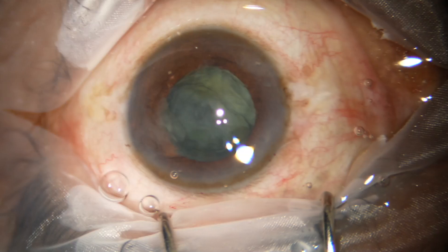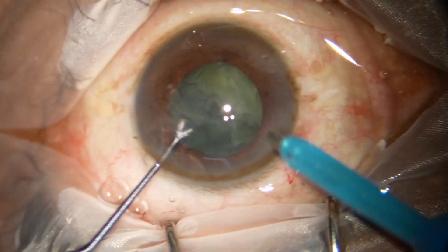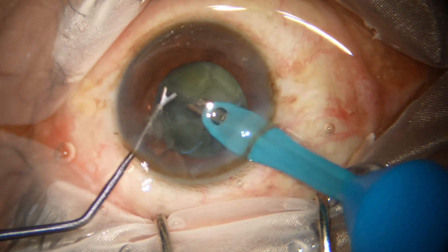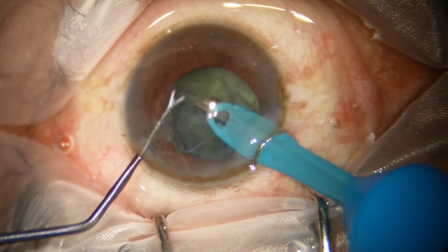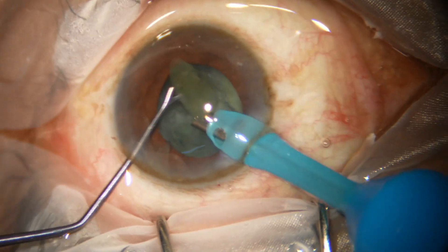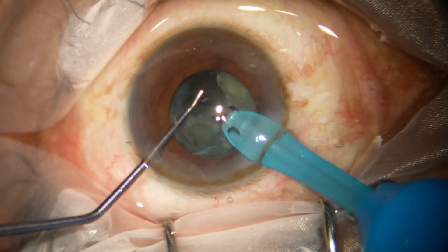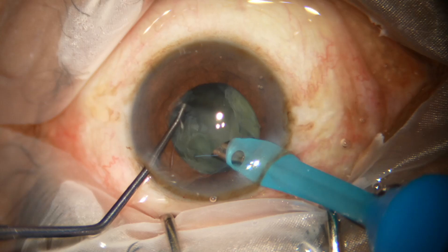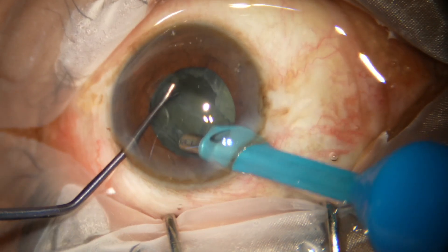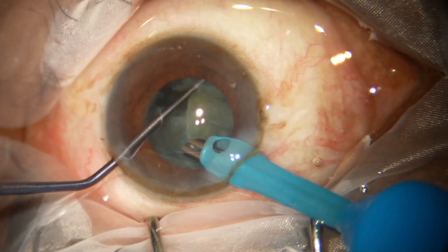Inject some more visco. And now the phaco needle goes in and I have taken a Y hook in my left hand to manage the nucleus as well as the iris. In case the iris tends to come down, I can hook the margin of the pupil and prevent it from getting trapped in the aspirating port of the phaco needle.